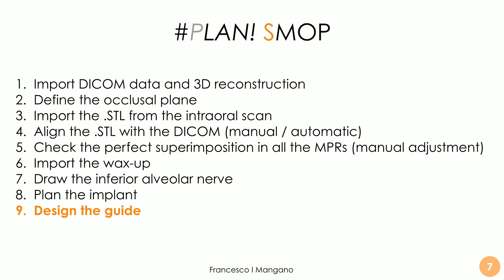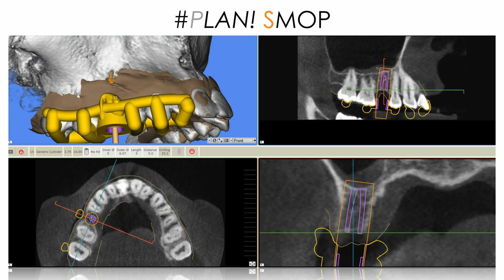We will talk about the design of the surgical guide in particular in this lecture. The guides designed in SMOP are peculiar because they are open-frame guides — tooth-supported, based on clamps that embrace the structure of the teeth. We can regulate the undercuts very well using the powerful tools in the software, in order to achieve perfect stability of the guide on the model and intraorally, and we have the sleeve as well.